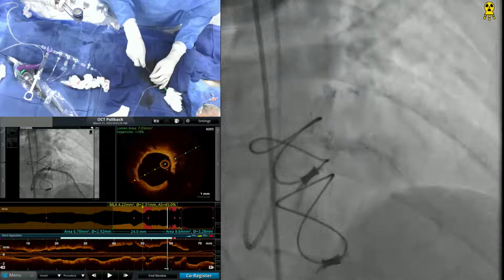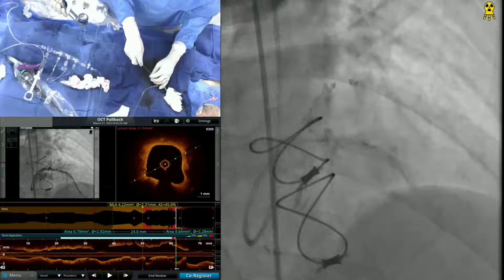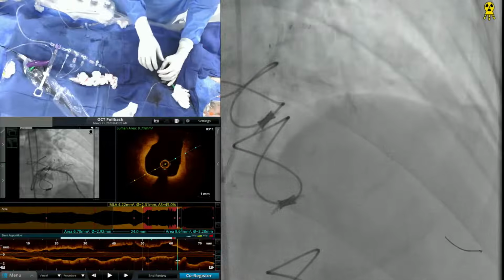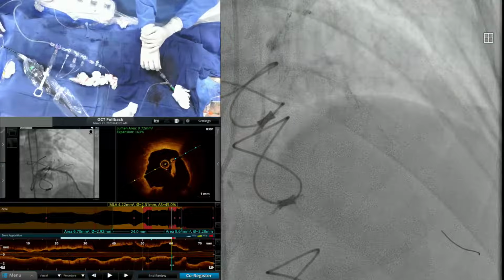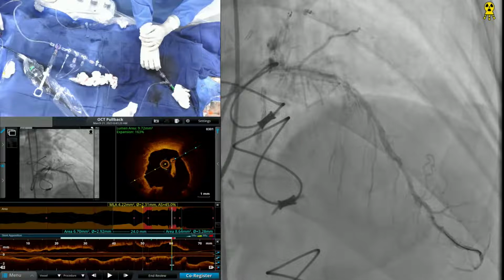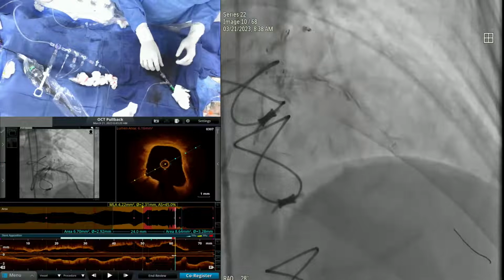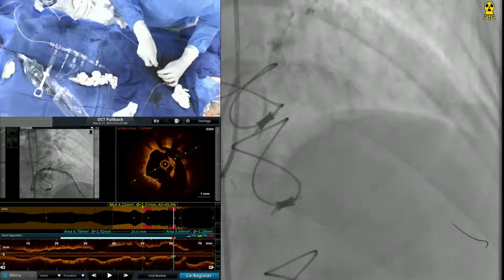Where I did, we went to 22. Here, I think we were good there. Now you're saying put a longer stent? Because we did not do anything distally. Let's take a good picture now after this dilatation, because if we need something, then we have to. Oh, you're saying just at the level of the septal? Yeah, right there. There is mild disease there. So just dilate with this balloon and put a stent. And then we need a 32. 3.5, 32 Promus Elite.